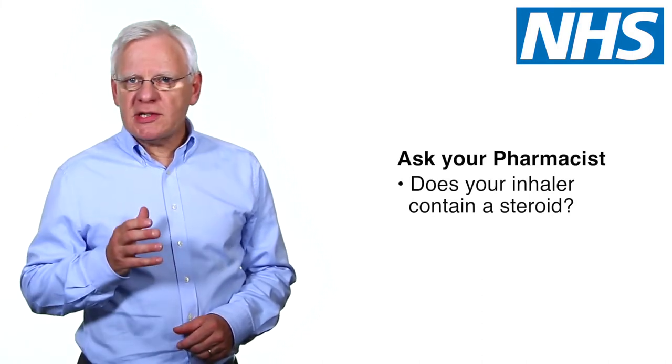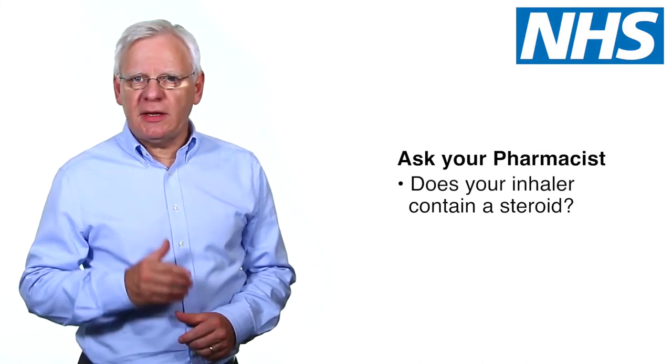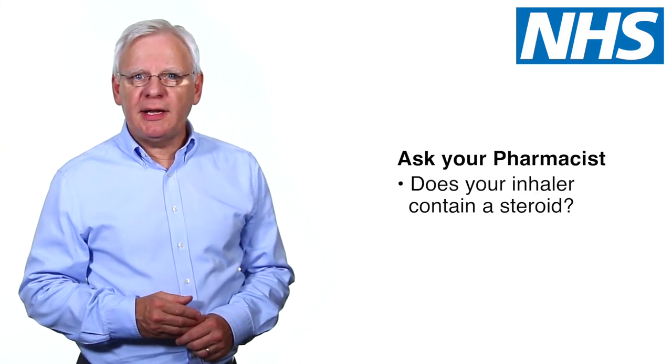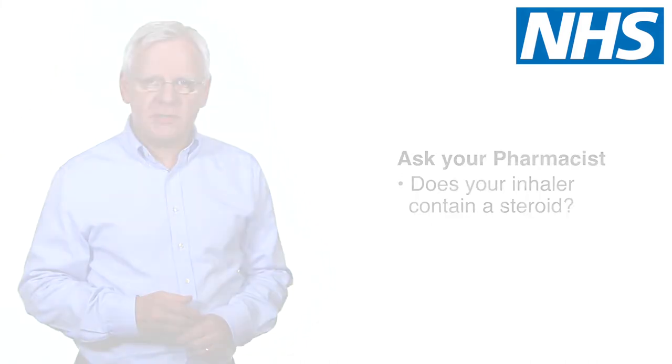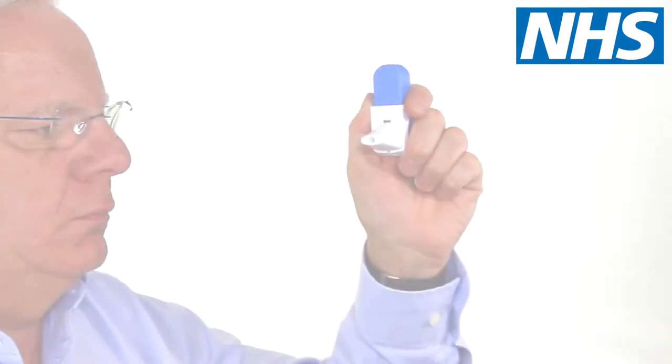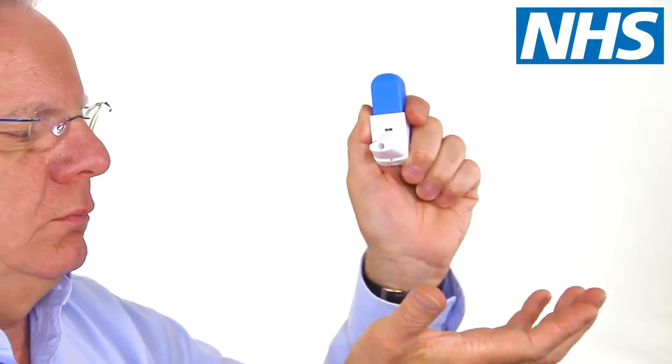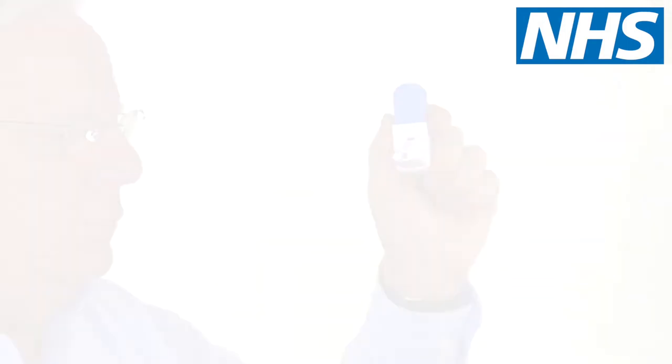If you accidentally click the easyhaler at any time, click it more than once, or breathe into the mouthpiece, you need to empty the powder by tapping the mouthpiece on a table or the palm of your hand.